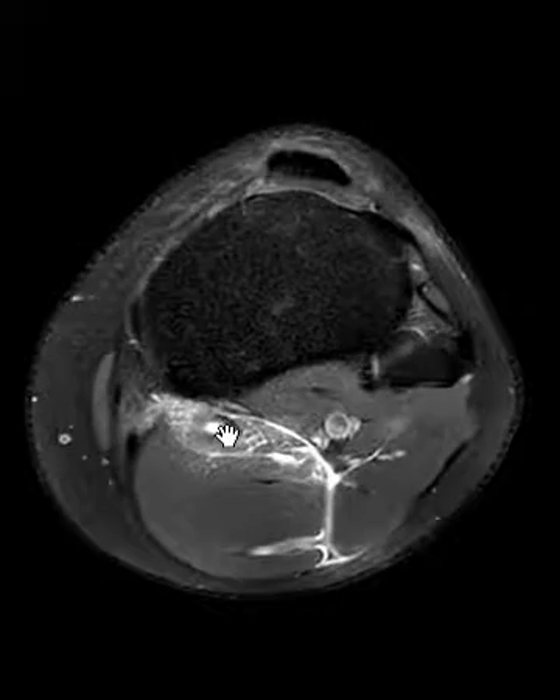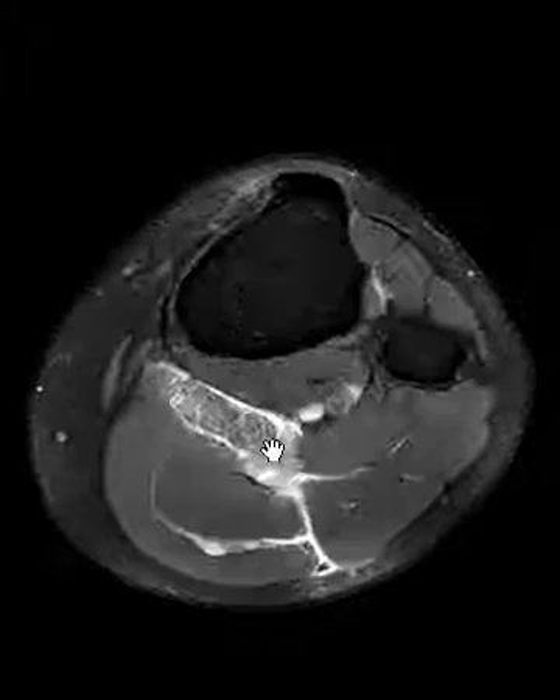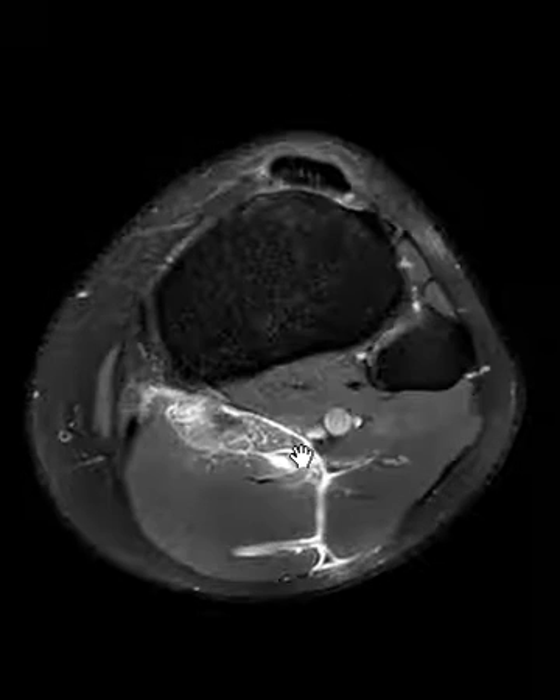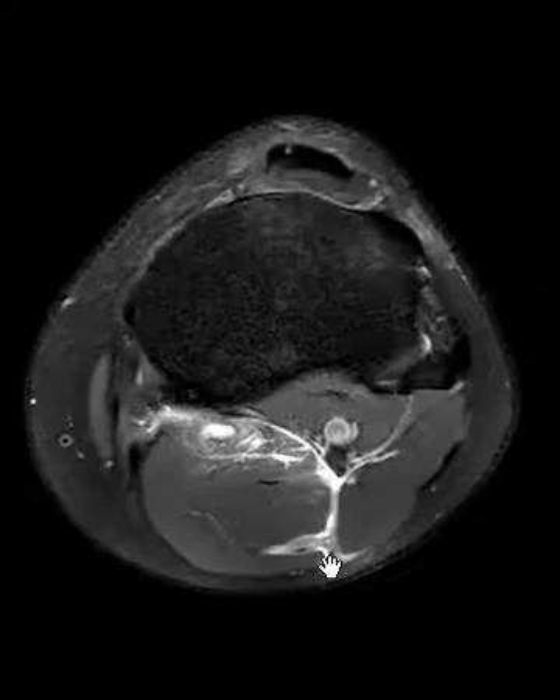We see hemorrhage — you can see that fluid right there is hemorrhage within the muscle belly. So there's a ruptured plantaris muscle and tendon, with fluid around it, muscle swelling, and also some hemorrhage insinuating back here in the calf.